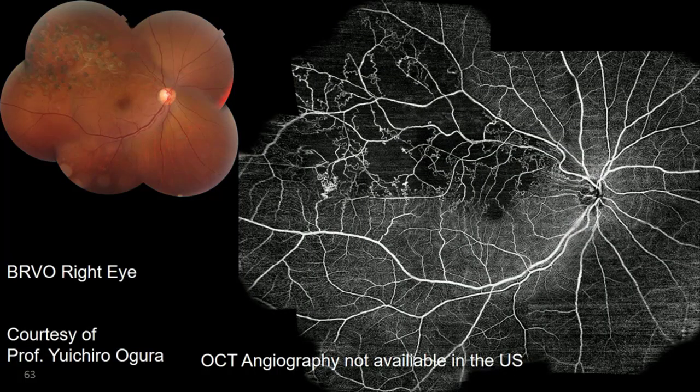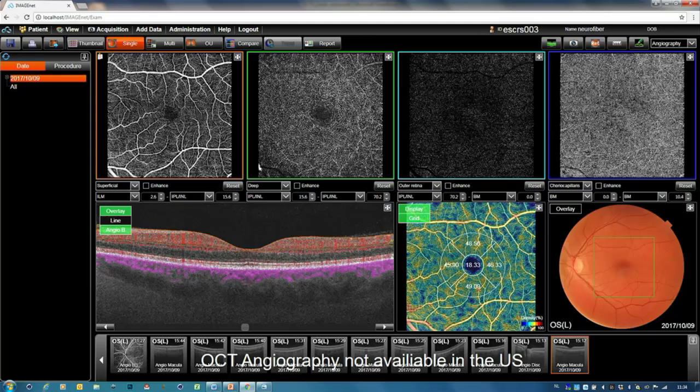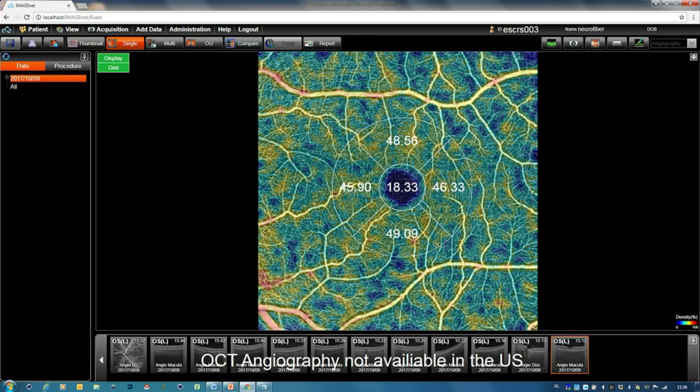Again, it's possible to use a very wide field mosaic to get a lot of information about ischemic areas, changes in the vasculature, and so on and so forth. We also have OCT analysis, as I was talking about. Again, not in the US, but in the international version. Here you can see the density maps, and you can move them around in any way you want to get those numerical values, and that can be very helpful.